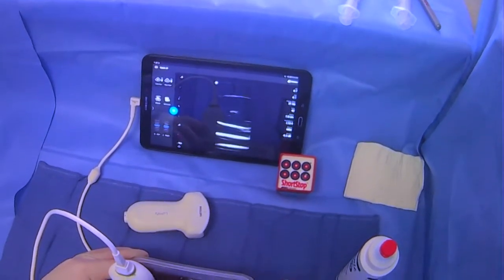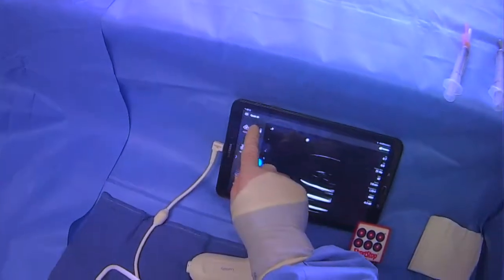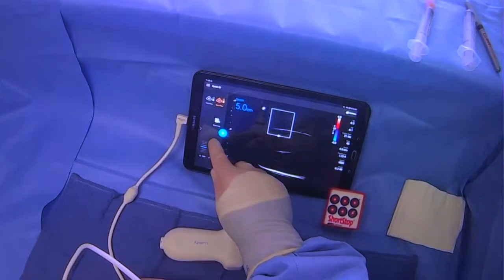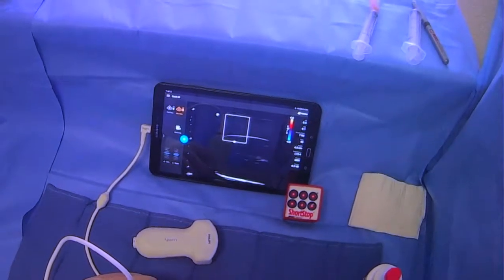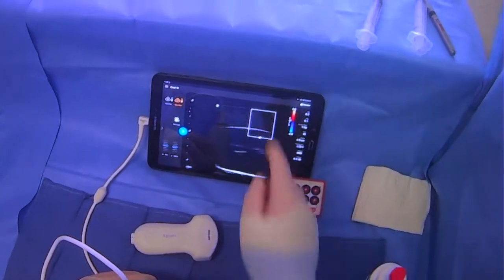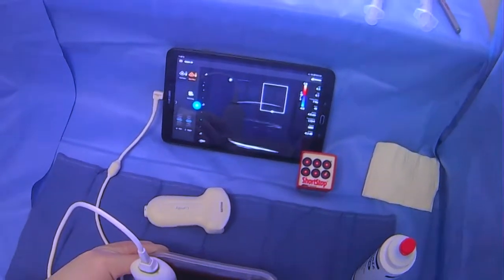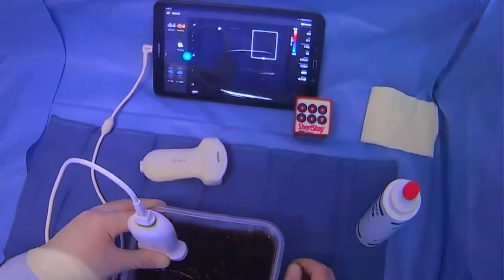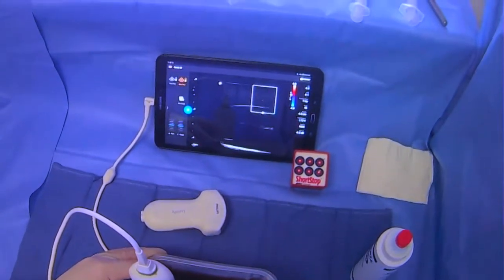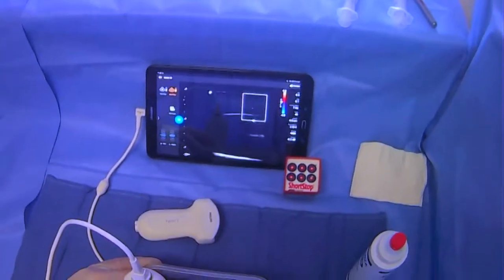The last thing you'll want to do, whether you're going to do the case with the curved probe or the linear probe, is put the linear probe on and get a sense of if there is any Doppler-able flow. If this region is going to be our trajectory and we're going to come from the right side, we'll just make sure that there's no Doppler-able flow and no vessels that will bleed if we accidentally go through them. This is generally very useful to do regardless of which probe you're using — you put the linear probe on at the end of your scanning to make sure there are no vessels, using color Doppler or power Doppler to assess vasculature in your trajectory.